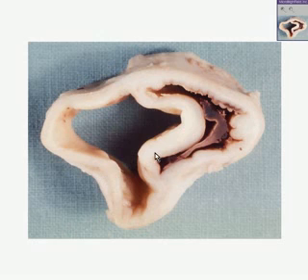And here is an area where blood has dissected through the weakened wall of the aneurysm. And sometimes you wonder, which one is really carrying the blood. Often, of course, the main lumen should be, but sometimes as the hemorrhage dissects through the wall of the aneurysm, you can find just as much real or clotted blood in there as well.